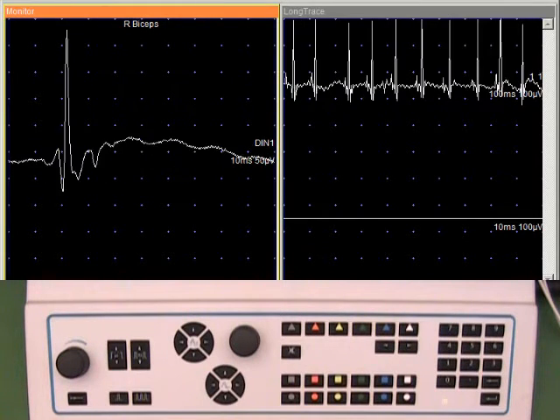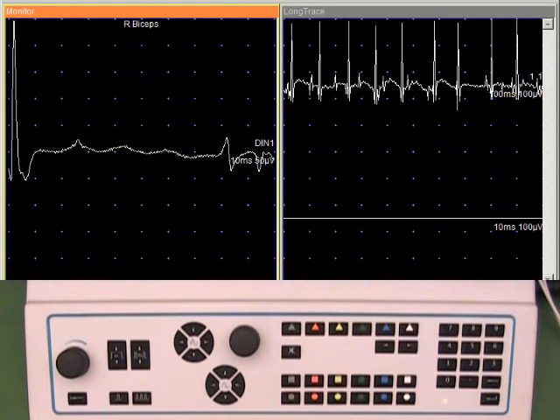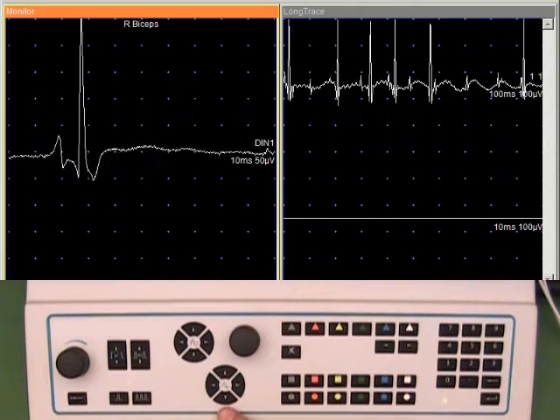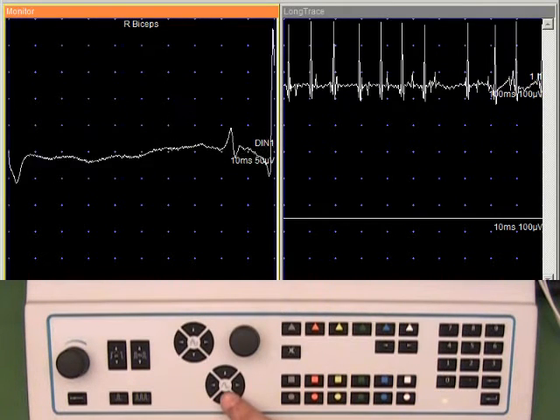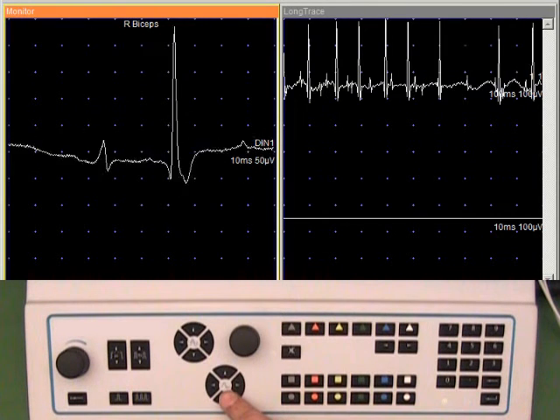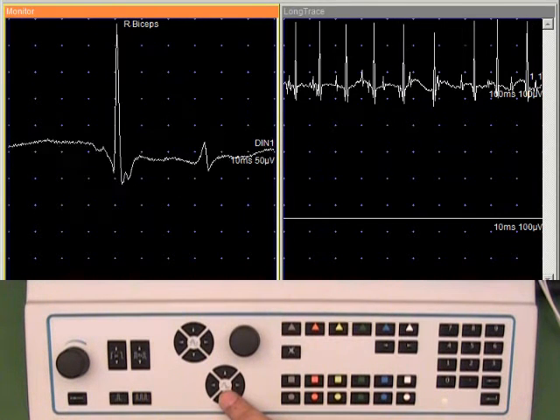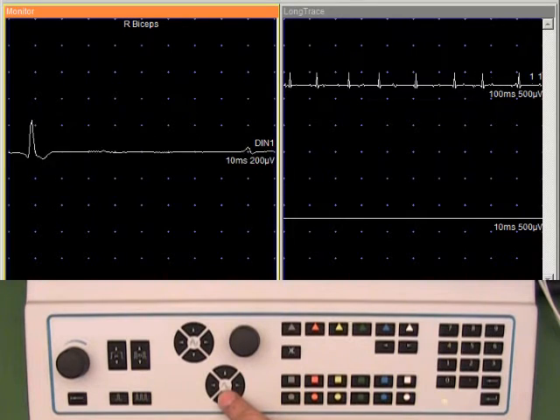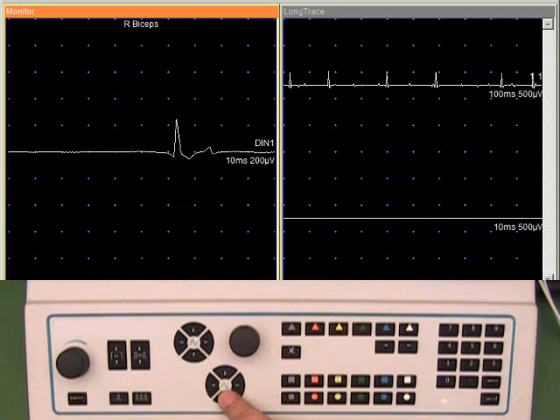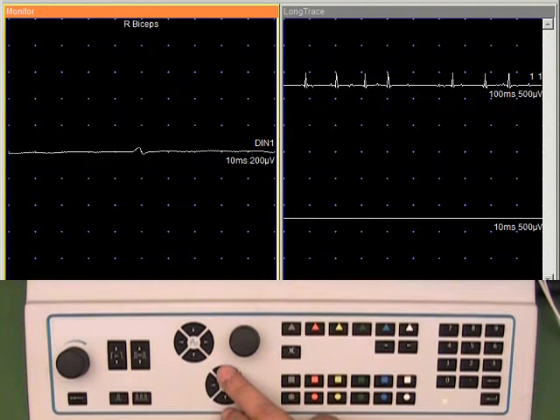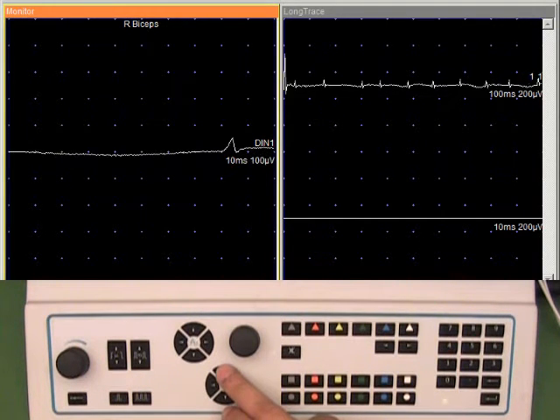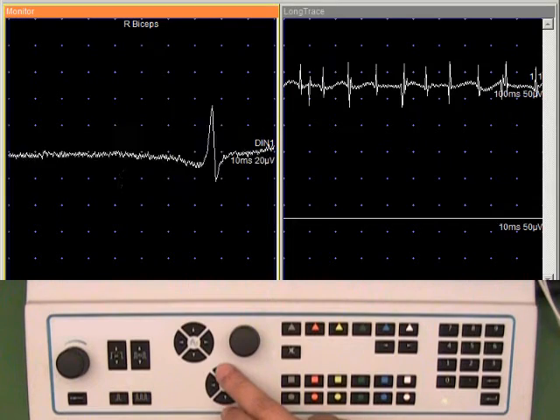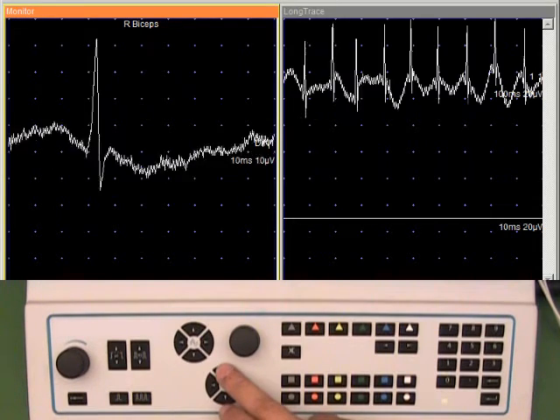We can adjust the gain by using the display keys. The down arrow will make the deflection smaller on the screen. Use the up arrow to make the deflection larger on the screen.